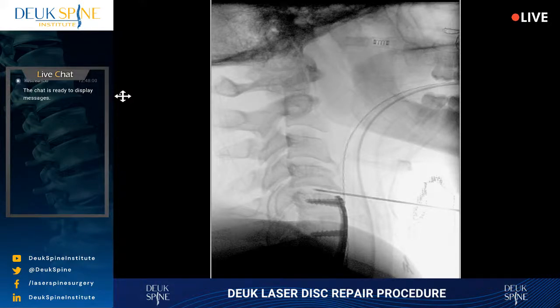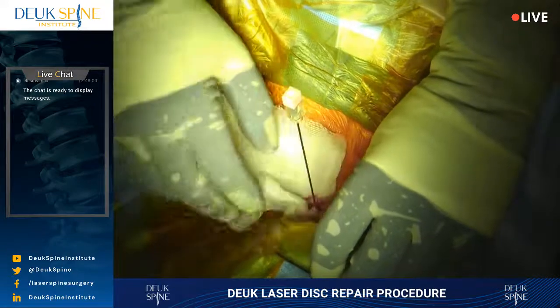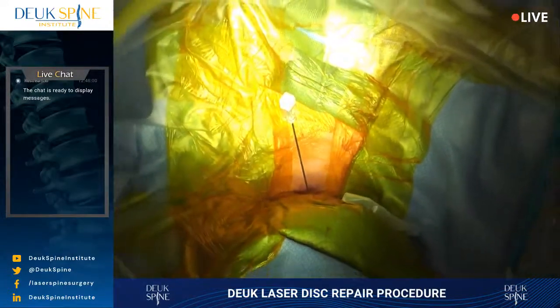So we are in the 2, 3, 4, 5. Everyone agree? And there's a giant disc herniation here. So we call this adjacent segment disease when a patient has a herniation that is above or below a prior surgery or fusion. You can relax now. Whoever's working over there. Yeah, we're in like Flynn, we're good.